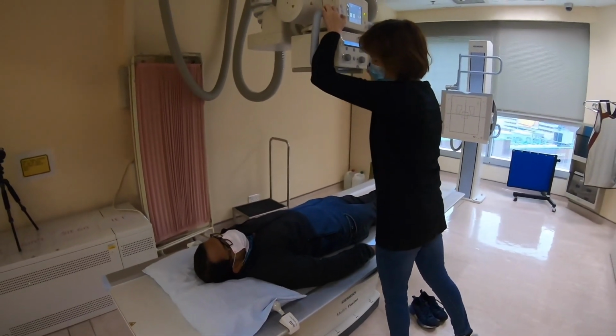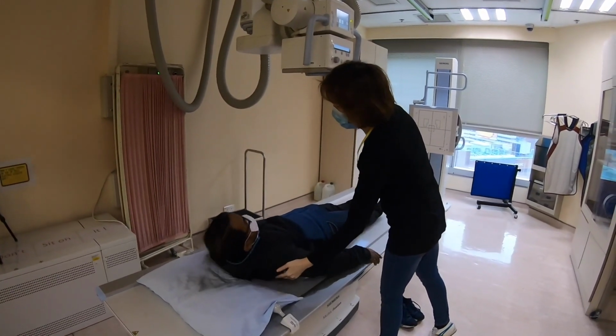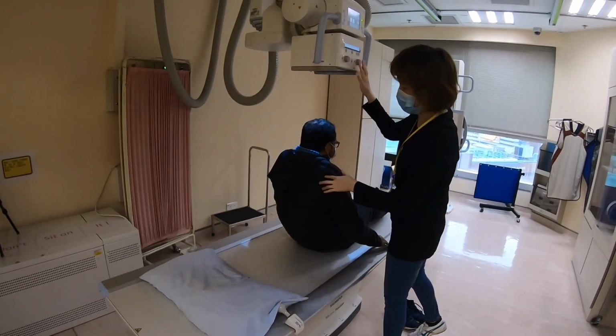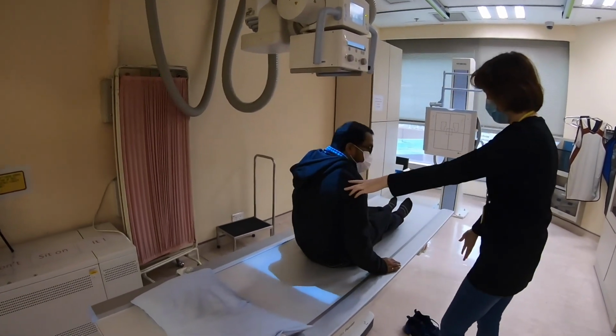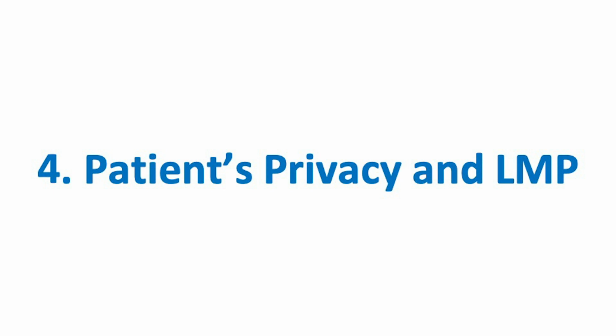So after you finish the examination, again, you need to raise your tube and ask your patient to sit up. If not, you will bump his head. Okay, when getting down. So it's finished. Thank you.